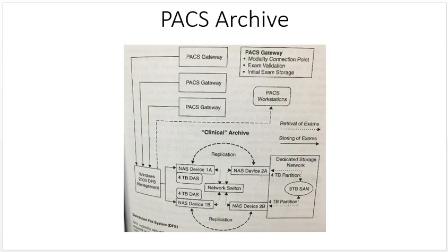Talk about the PACS archive. Keep in mind that this is just a drawing of somebody's design, mostly to explain the archive, so I don't want you to be alarmed when you look here and you see 3 PACS gateways. PACS gateways are also known as DICOM servers. I know I've told you repeatedly never to use DICOM servers in odd numbers, but hey, this isn't my book, this isn't my drawing, and really it's not what this drawing is all about.